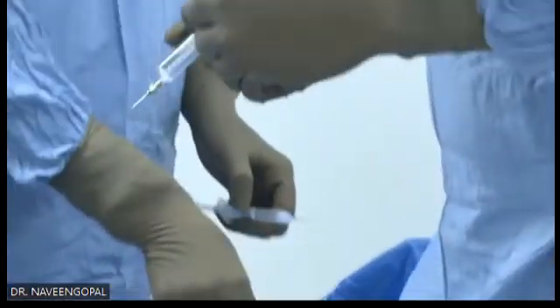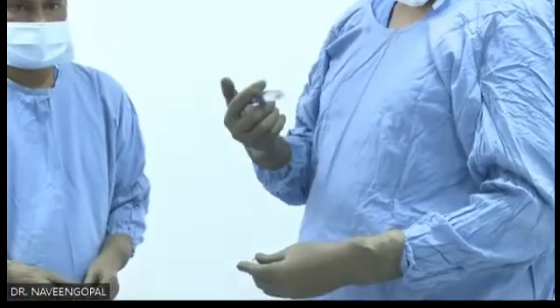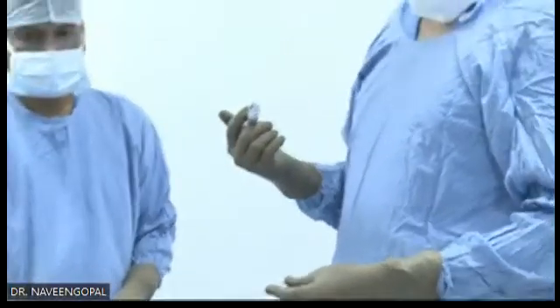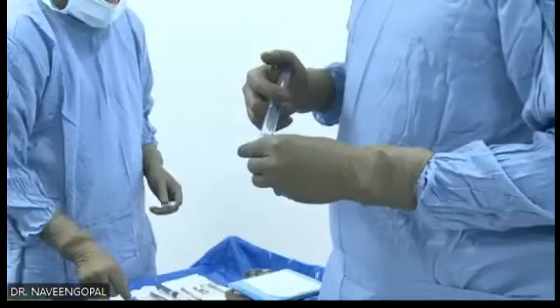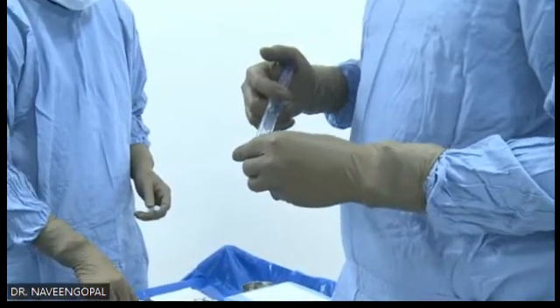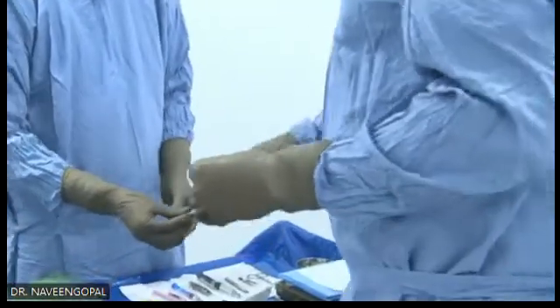This is plate haptics for cataract surgeons. For a cataract surgeon who has loaded plate haptics, it is the same principle. Before loading, I just wash my cartridge and fill it with visco.